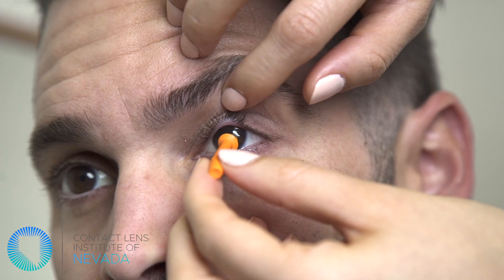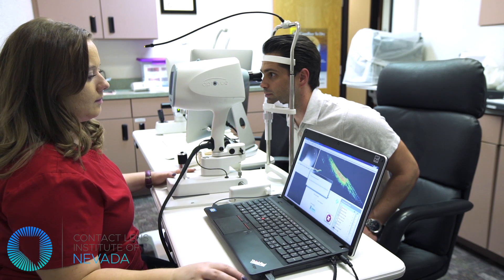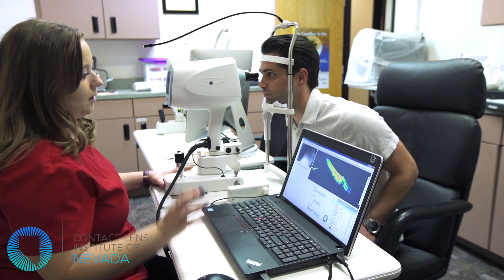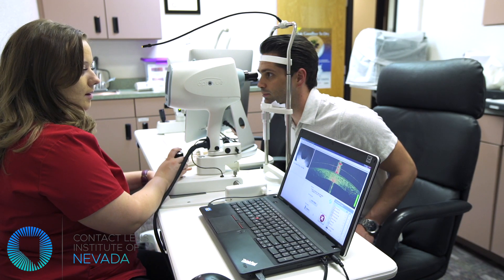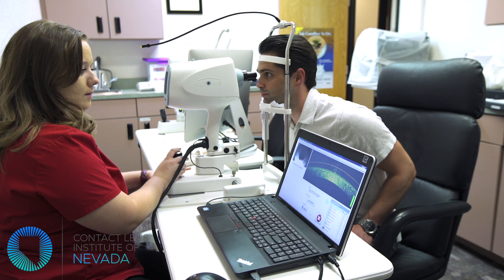At this time, they might remove the lens and try on a different lens to achieve a better fit. Once the practitioner is satisfied with the lens fit, they might perform a few more tests using different instruments to evaluate the fit at the highest level. It is very common to wait 20-30 minutes prior to performing these tests to allow the lens to settle into place.